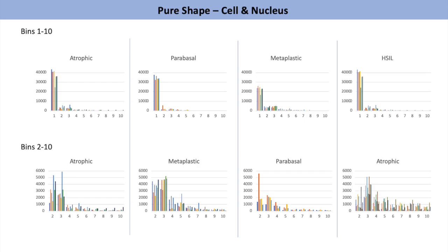So these are the first 10 frequency bins for the 4 categories that we compared. You can pause the video to explore these graphs if you want, but I will move on to talk about the indices that we found to be interesting.